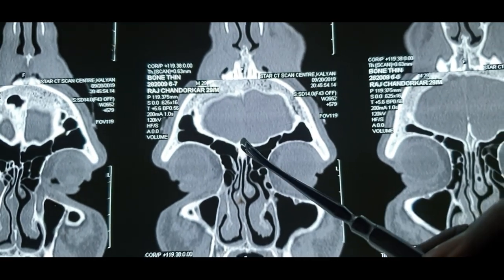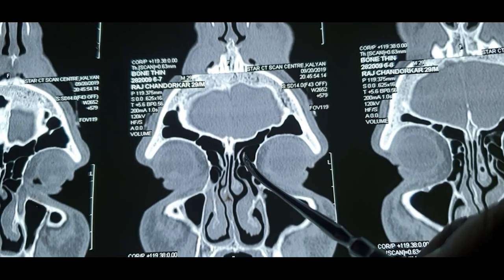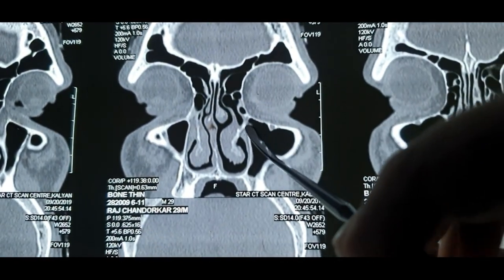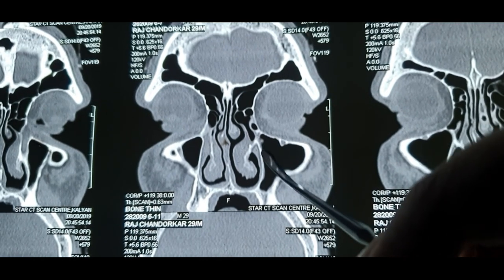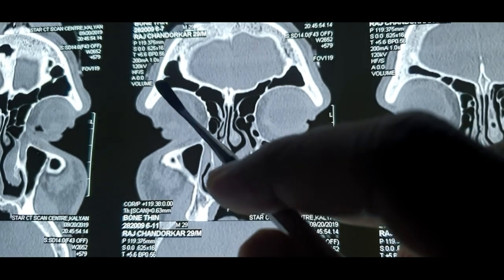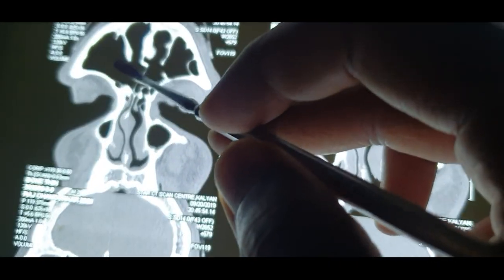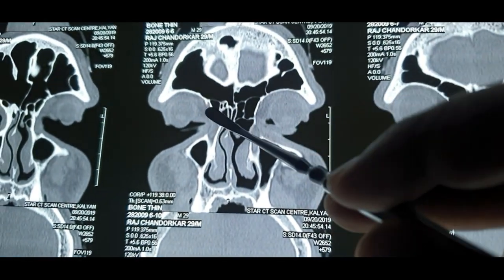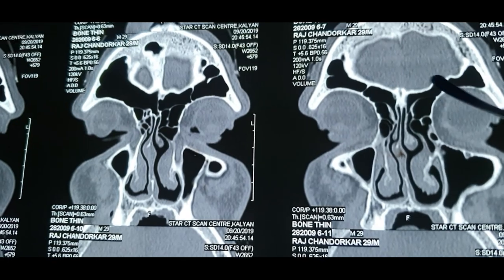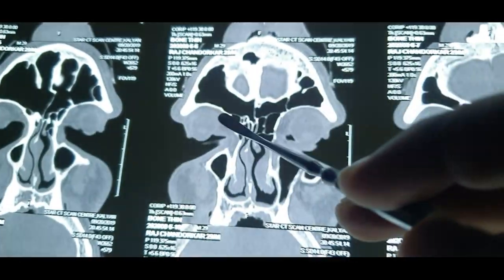So this patient is having a lot of pneumatization, that is why all the structures are pushed behind posteriorly, because normally this is a maxillary sinus, this is a maxillary sinus, and this is the supraorbital cell. This cannot be frontal sinus. Frontal sinus just posteriorly was here. This is a frontal recess which ended here, and this is the supraorbital cell. Because of the excess pneumatization, all the structures are pushed posteriorly.